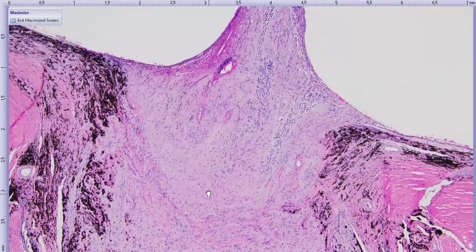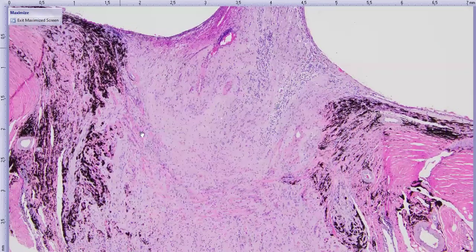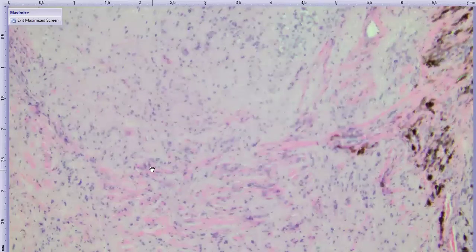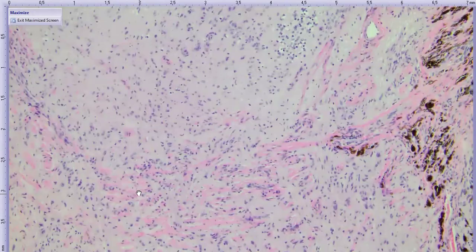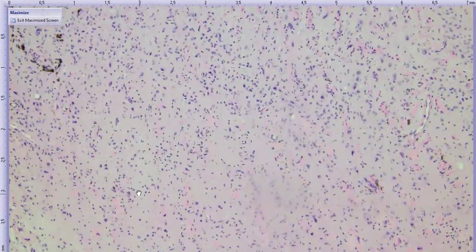And then when we look back here, this is a nice example of optic nerve head atrophy, that you might initially say, well, it's sort of hard to say what's going on with the optic nerve head because of the detached retina. But actually what we're looking at right back here, I'll go higher mag, is the lamina cribrosa, which is that meshwork of collagenous beams through which the axons of the retinal ganglion cells traverse, and then they become the optic nerve posterior to that.